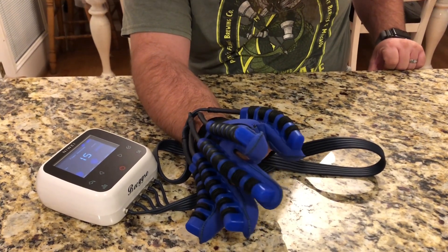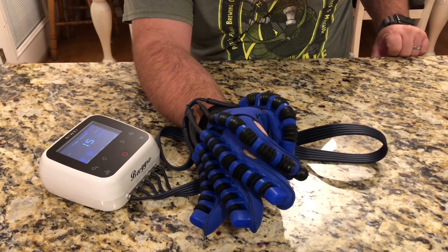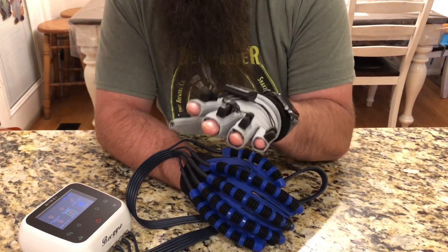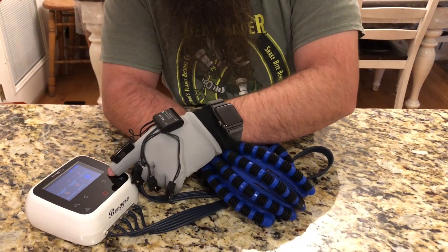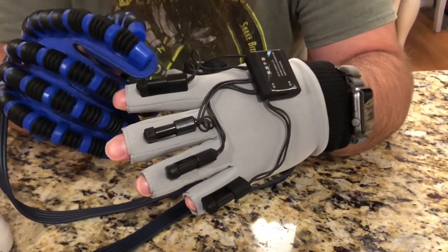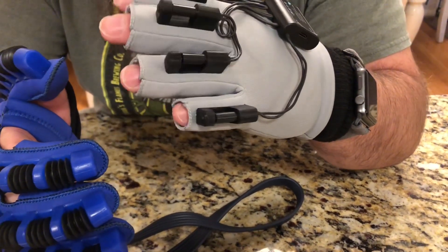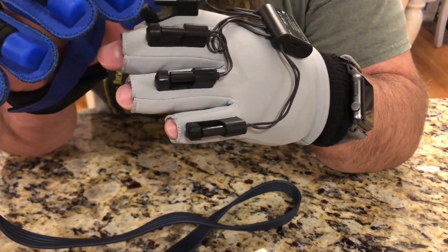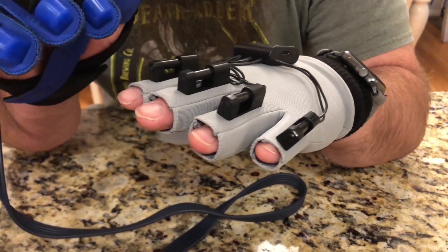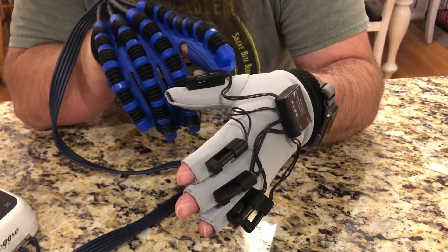I went ahead and put on the second glove and we're gonna try out the mirroring mode. One thing to make sure you do is adjust each one of these sensors for the length of your fingers — you can see how they come apart when I flex. You want the cylinder to be touching when your hand is relaxed, so each sensor needs to be set to the right position.